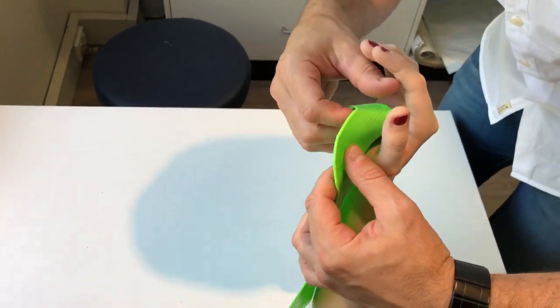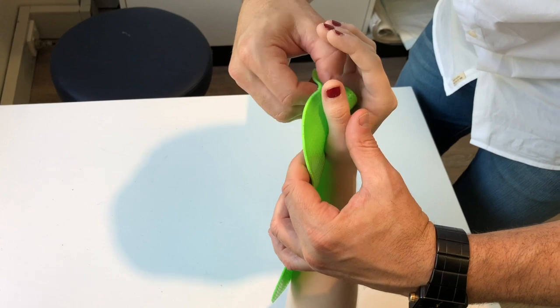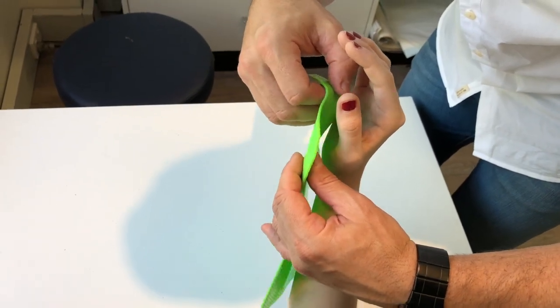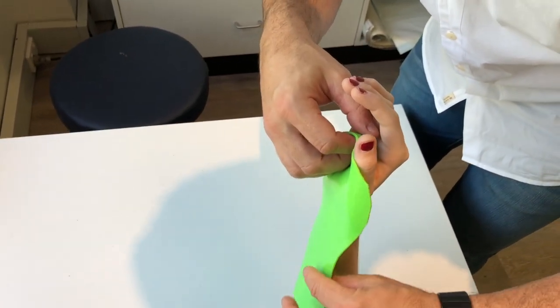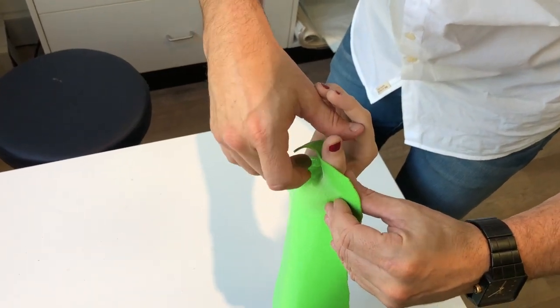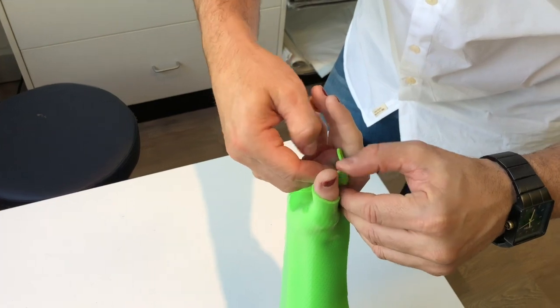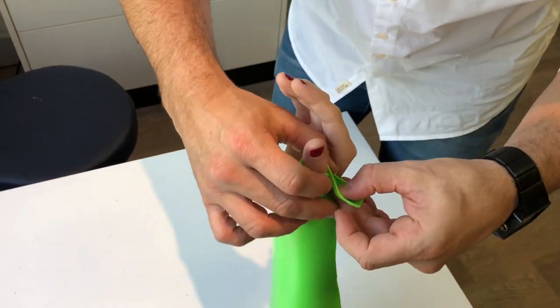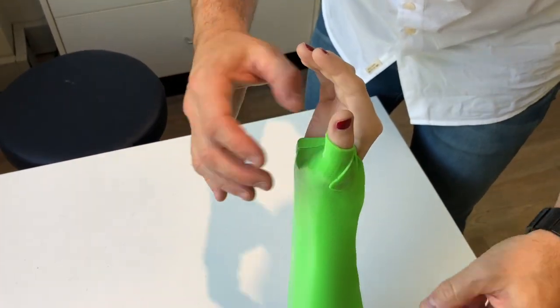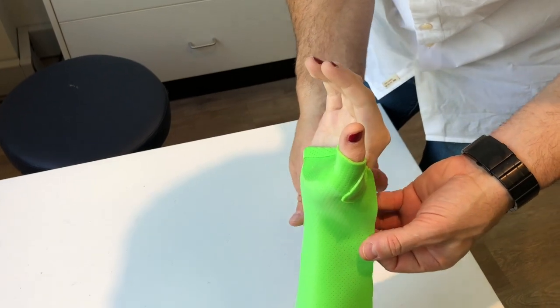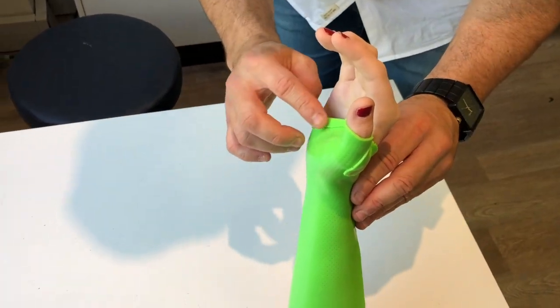So we're aligning, making sure it's in line with our distal palmar crease. Aligning the thumb piece and then we secure it by bringing the tab around. Our tab comes around. The splint's secured. We're using the stretch in the material.